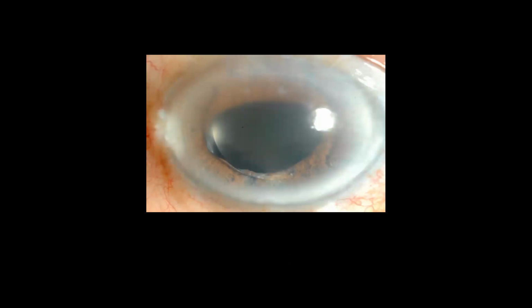So what's this? Okay, I'm presented with a slit lamp photo of the anterior segment of the eye with diffuse illumination. There is peripheral corneal opacity, mostly peripheral, but also involving the central. And there is a lens anterior to the iris, right? Yes. There is an IOL anterior to the iris.